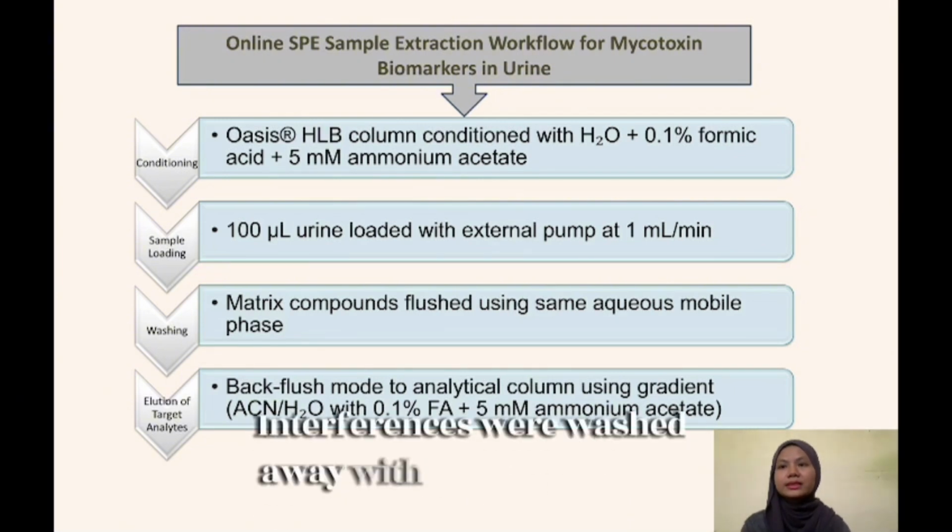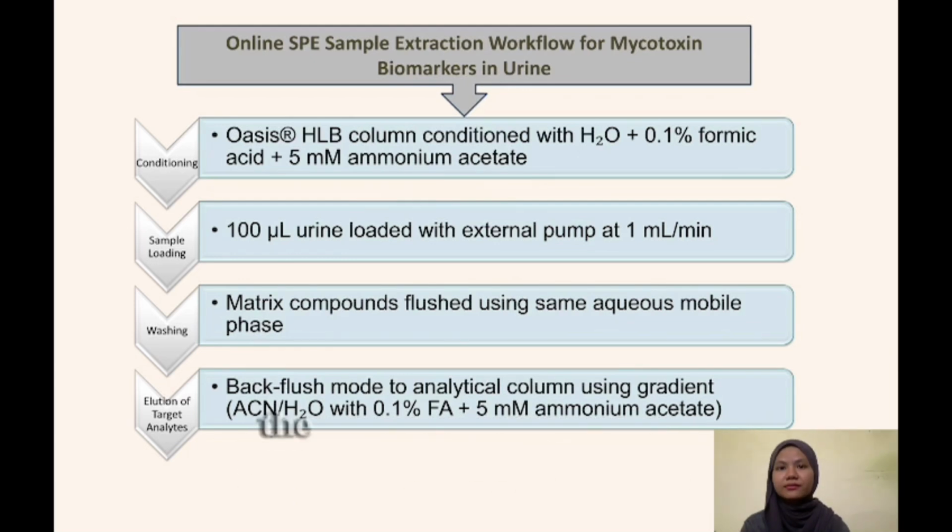Interferences were washed away with the same mobile phase, and after 2 minutes, the valve switched to allow backflush elution of the analytes, which is the target analytes, to the analytical column. This setup minimized manual handling and enabled sensitive high throughput analysis.